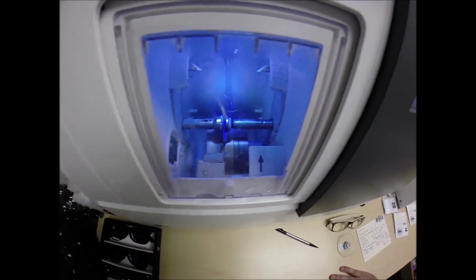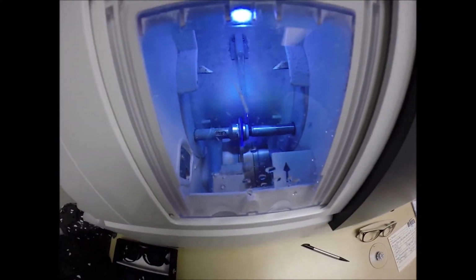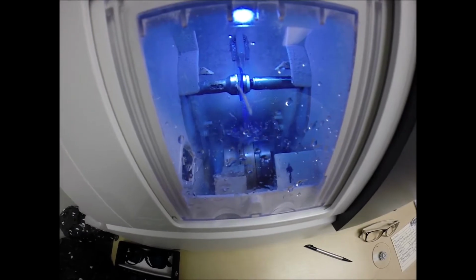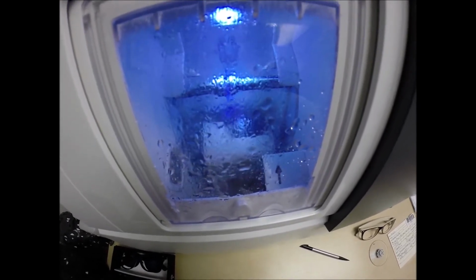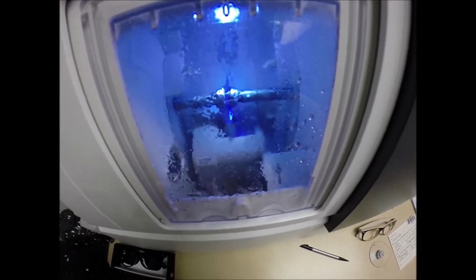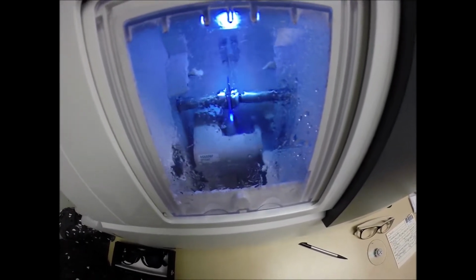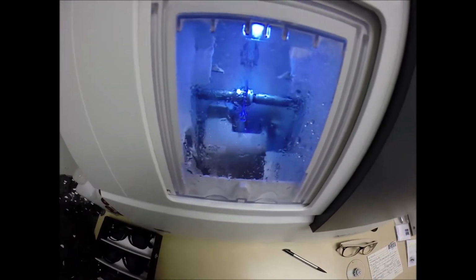Now water has begun spraying on the lens, which reminds me that I need to take a bath. But no, it tells me it's in the last 20 seconds of the cutting cycle. In just a moment, a lever will come out from the front. Cue the lever. At the end of that lever is a small spinning disc that's going to apply the safety bevel to the back surface of the lens. And the reason why it does that, I'll show you in just a moment, but you also got the anti-glare coating, which is 3 features in one.